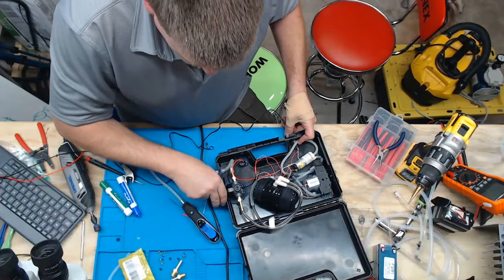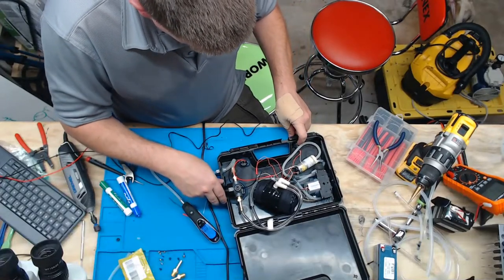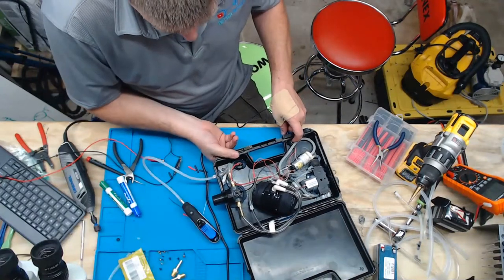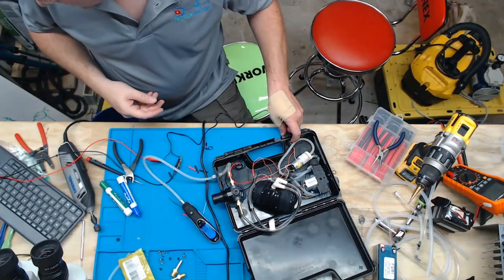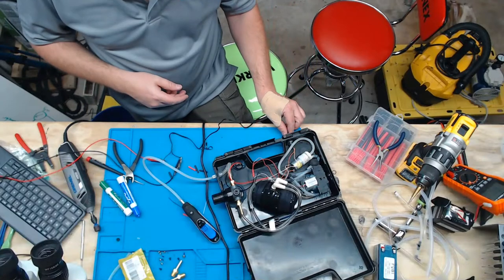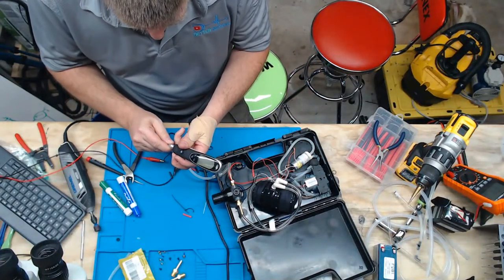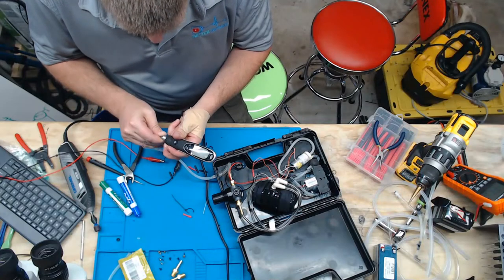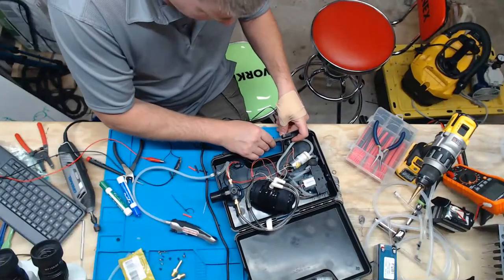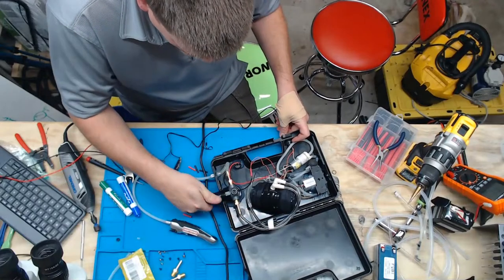Okay. Oh. All right, guys. Well, I think I need to finish up and get the rest of the correct connectors for what I need to do. That's full of air.